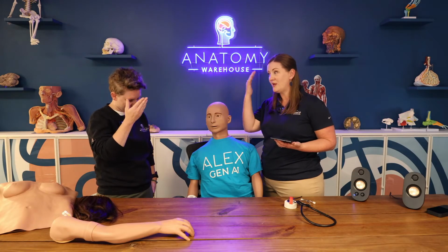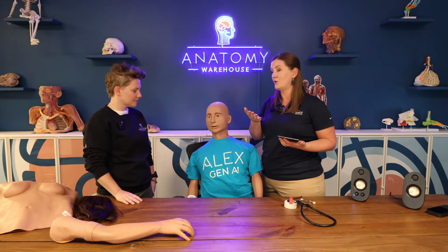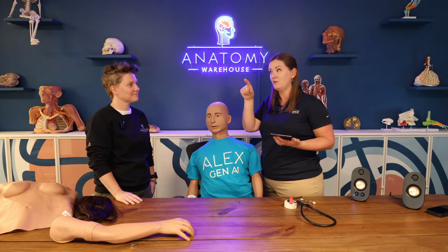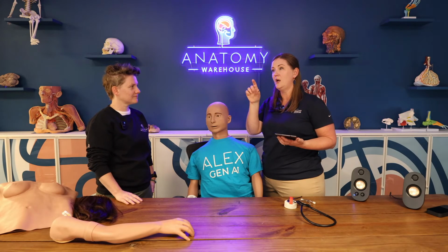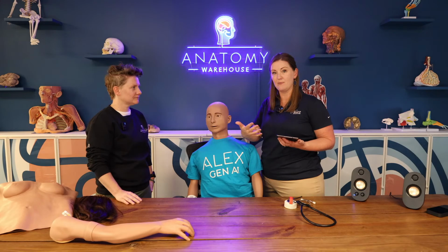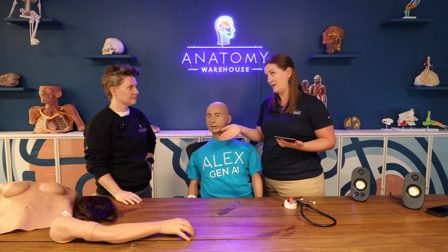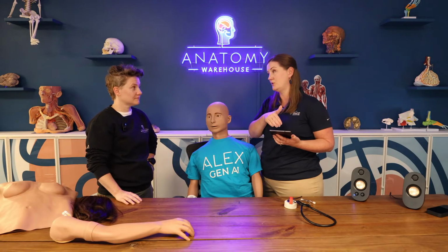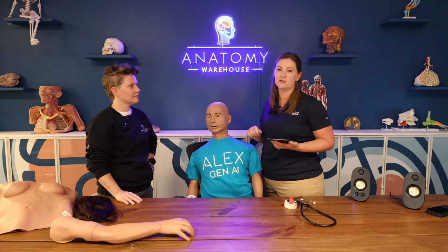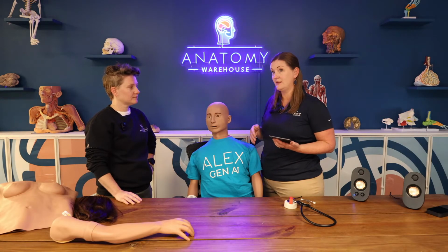Or they could also make themselves little notes too about their generated patient. So as they're working with the software platform, they can generate their own patients. And maybe through the course of the simulation, they go, ooh, what I really wanted was to see Alex's blood pressure bottom out after he says that he has a stomach ache and he has a headache. What I wanted to see was the blood pressure bottom out, and then the students would have to do something additional. So they can make themselves little notes in the simulation log too, to help them remember, like, ooh, I want to add this, I want to change this, I want to edit this and make this ever so slightly different. And they have access to those patients, and they can make as many patients as they like.